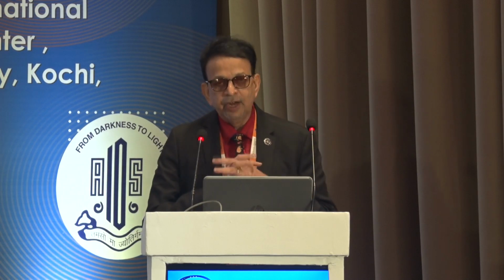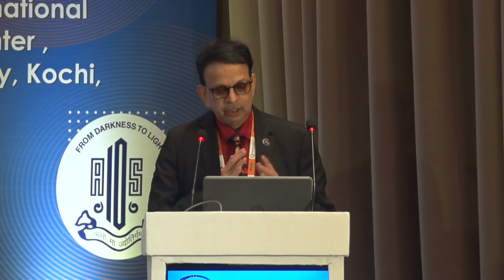Again, small pupil hard cataracts, if the pupil is less than 5 or 5.5, my cutoff is around 5.5, I go ahead and do the femto, and that is the biggest advantage because already the rhexis is there. Another advantage of the Catalys machine, it cuts beyond the rhexis margin. So it makes life again very easy. Reduced surgical time, reduced effective phaco time, more precision, clearer corneas, and reduced complications.